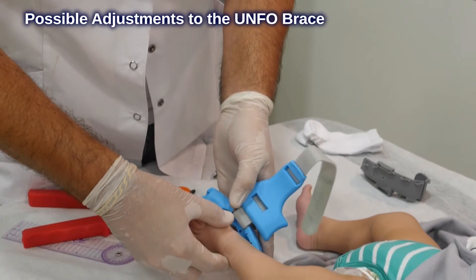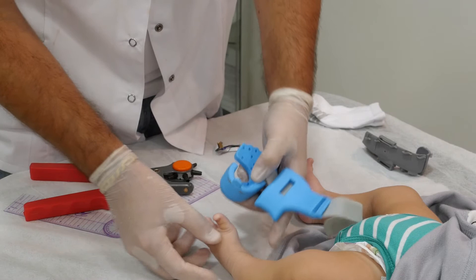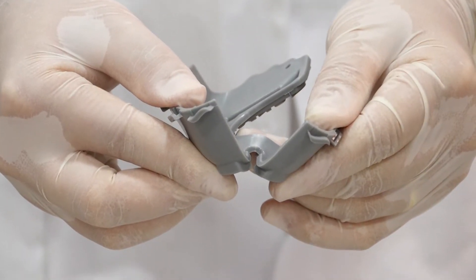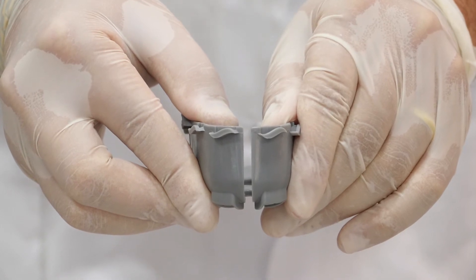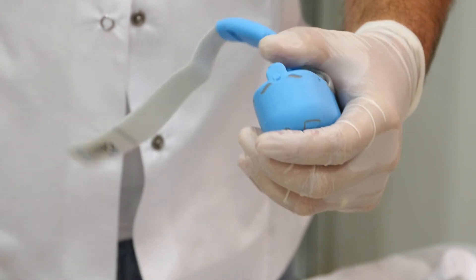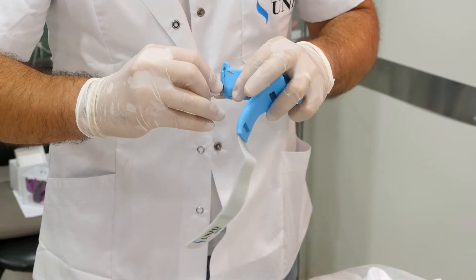You can make adjustments to the Unfoe brace if needed, depending on the foot shape. The first adjustment is the enlargement of the ankle area. The back side of the inner part of the Unfoe brace is bisected to release pressure from the ankle area, in case the baby's foot is wide or large in the back. The enlargement is performed by making a hole in the designated area and making a cut all along to the bottom of the ankle.